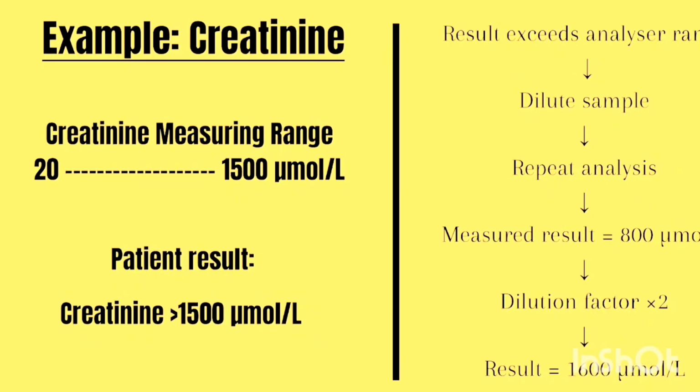The same thing. If it does give you a result, you can't rely on that result, because the result is outside the linearity, outside its measurable range. The key word for linearity is over a specified range, over a measuring range. The same thing is applicable with the calibration, it is a range. So the analyzer gives you a result using a particular range. Once the result falls within that range, that is within linearity. Once the result is outside that range, that is outside linearity.